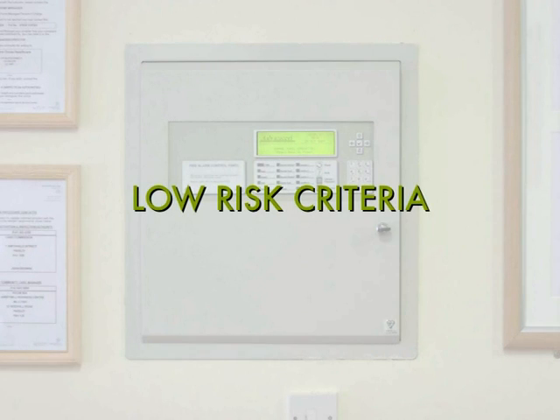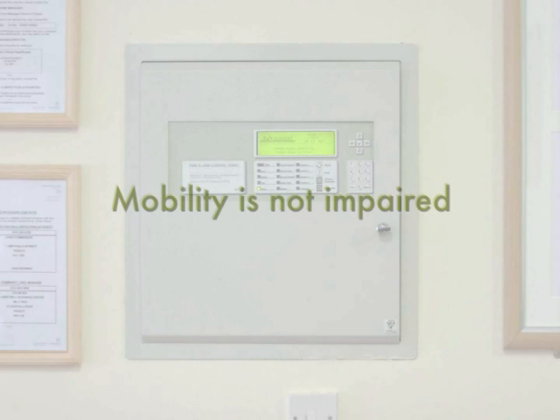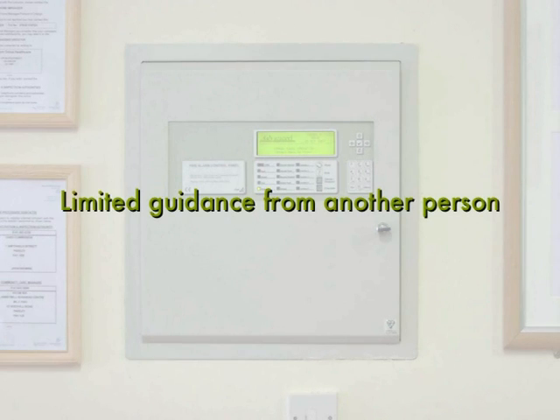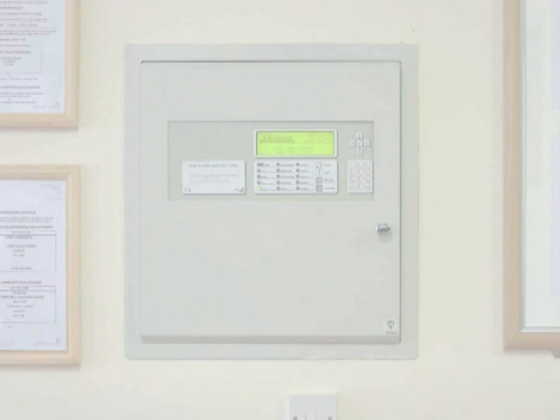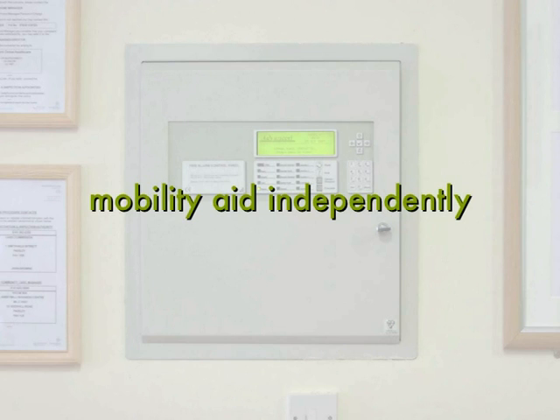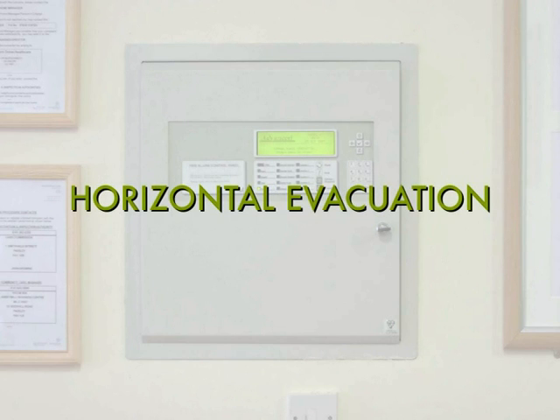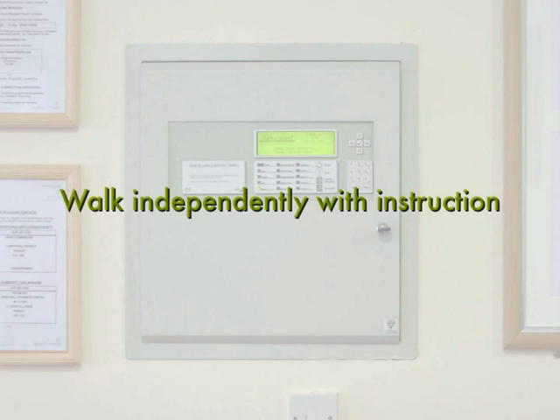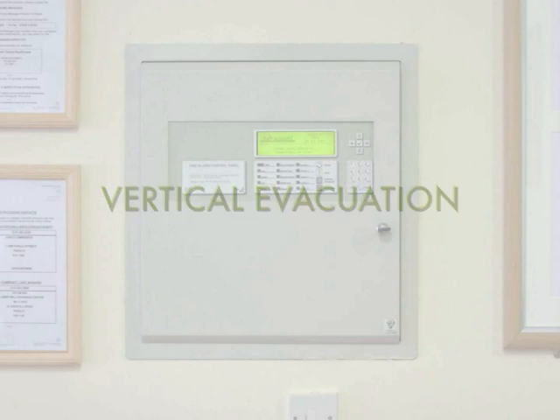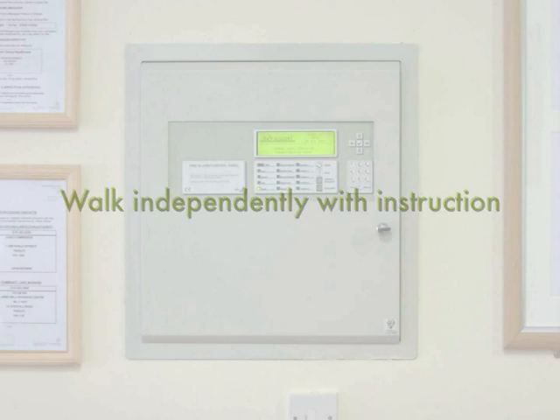In the low risk or green light criteria, the service user's level of mobility is not impaired in any way, and they are physically able to leave the premises without assistance of staff. If they experience some mobility problems, they require limited guidance or assistance from another person. These service users should be freely mobile or use a mobility aid independently and can follow instruction. For horizontal evacuation, the service user should be able to walk independently with instruction. For vertical evacuation, the service users should be able to walk independently with instruction, negotiating the stairs with no difficulty.